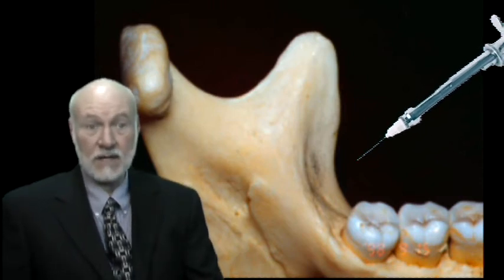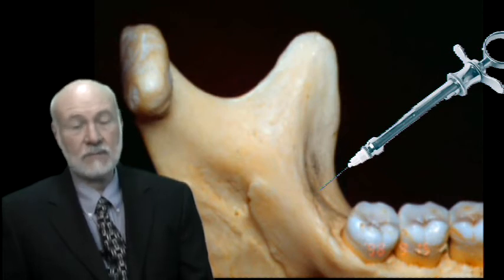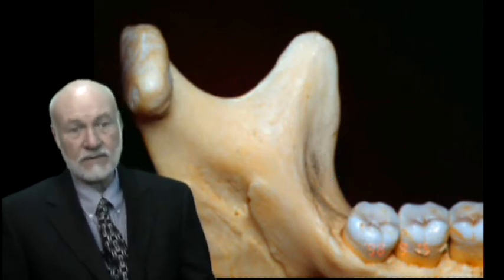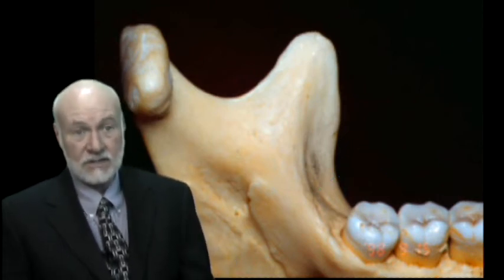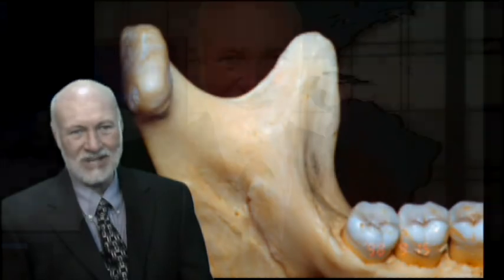And we all know that the long buccal can be a very painful injection. This is going to be much more predictable and easier to administer. You don't have to fight the teeth, the tongue, the cheeks, and everything inside the mouth. So just give it a try. I think you might enjoy adding this to your armamentarium.